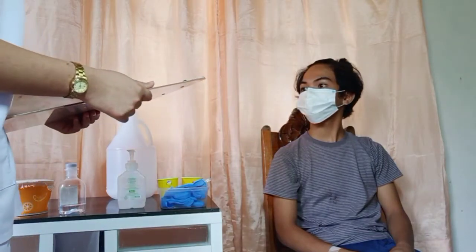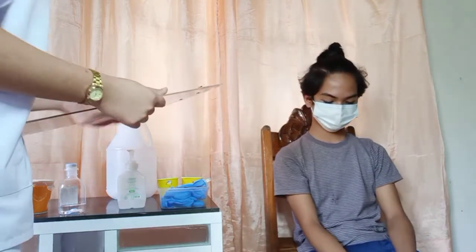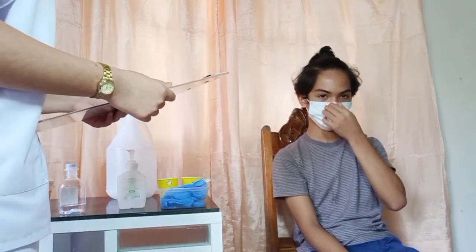Good morning, sir. I'm Catherine Ruiz and I am a student nurse. I am assigned to give you injections and medications. But first, sir, let me know your name.